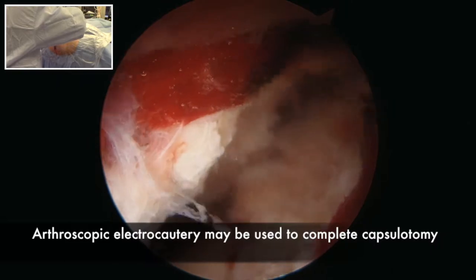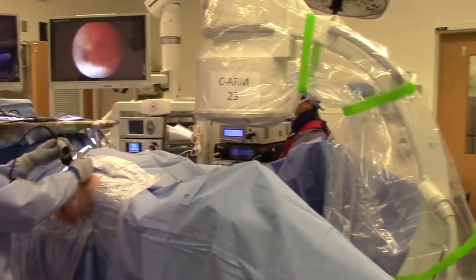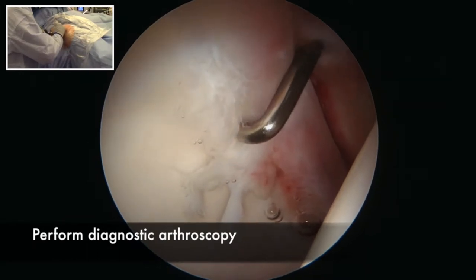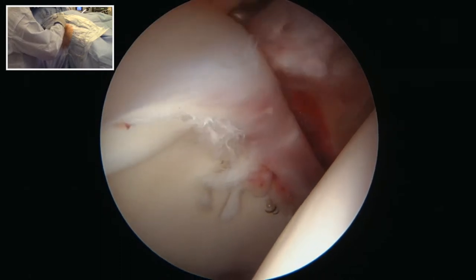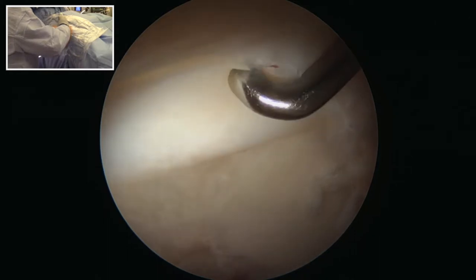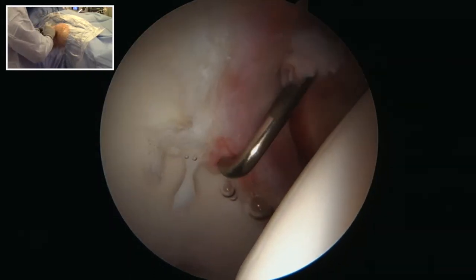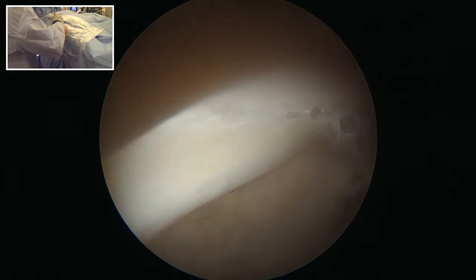Once the capsulotomy is connected, you'll have free access to the joint. From a diagnostic arthroscopy, it is critical to characterize the pattern of damage in order to plan the repair. Here, he has a labral tear as well as a chondral wave sign indicative of longstanding femoral acetabular impingement. The labrum is unstable with loose fragments anteriorly.